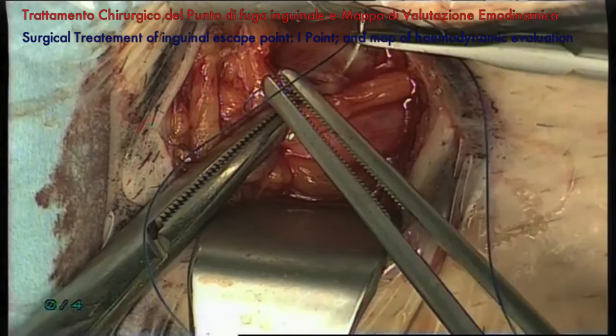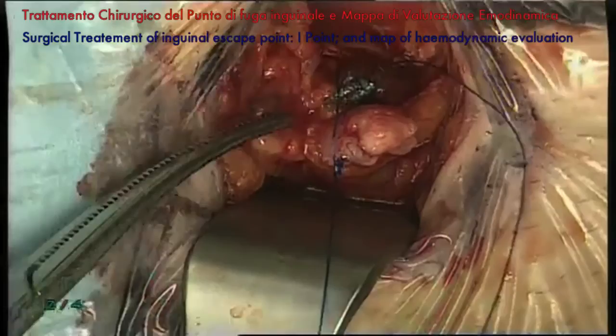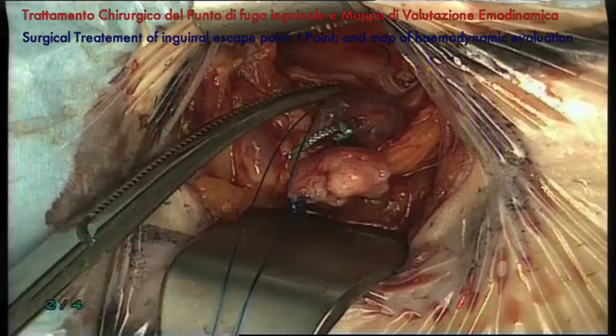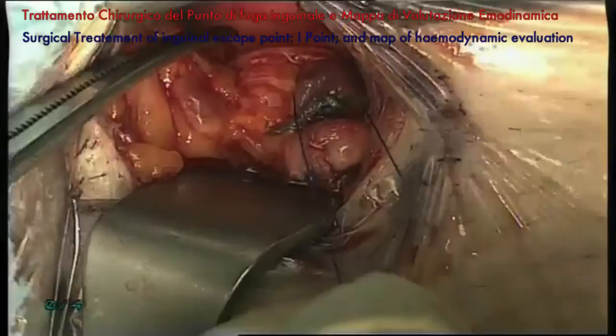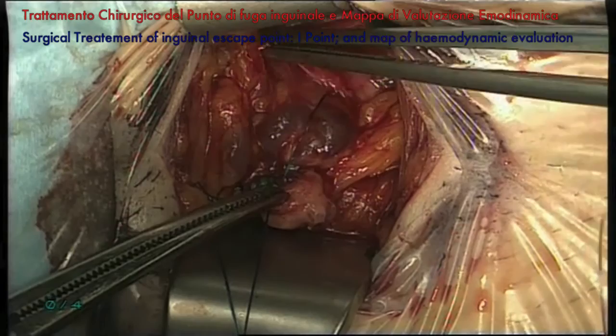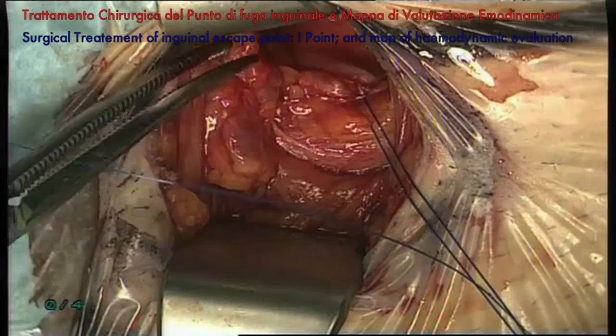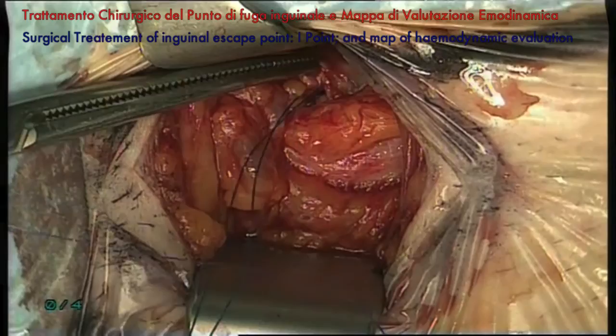Tagli questo occhio, dov'è il nervo, Paolo? Il nervo, fammi vedere, taglia l'ago, tieni qua, fammi vedere dov'è il nervo, tieni giù, dopo tieni su con una pinza la fascia. Controllo ulteriore. This is a further control. Vabbè, devi tirare sulla fascia, Paolo. L'ho preso? Dammi un attimo. Sì.